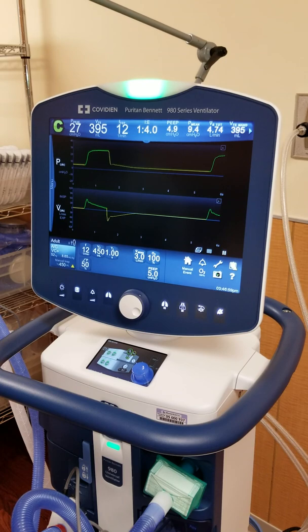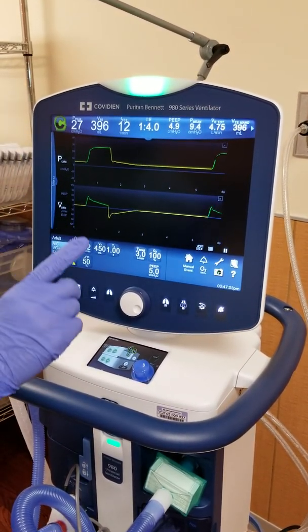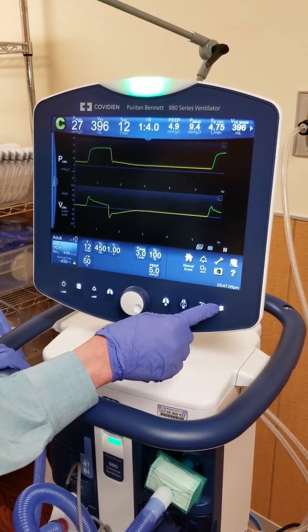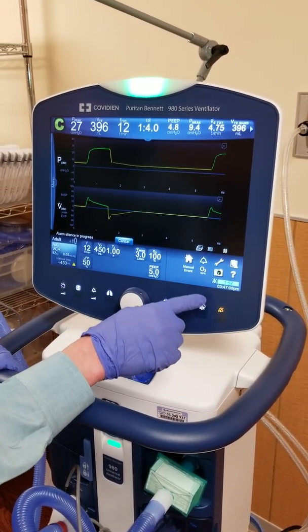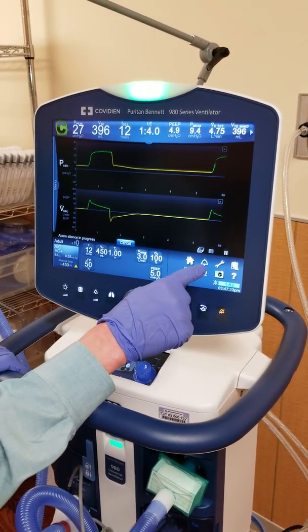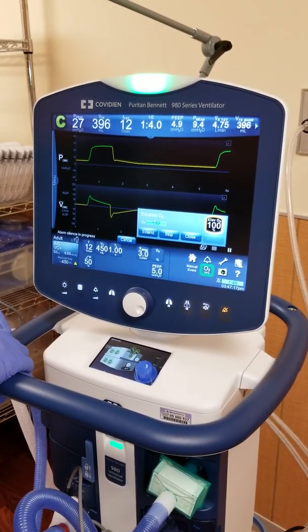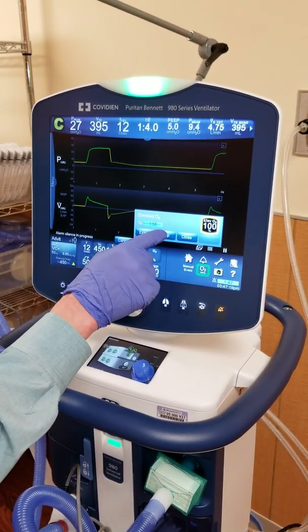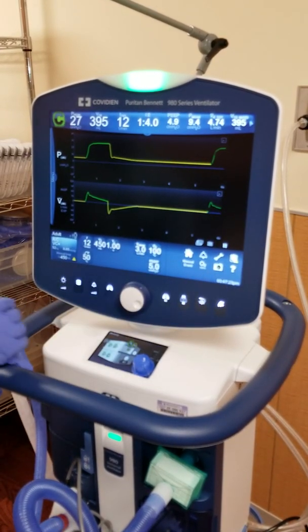Another important thing to know, this button right here is the alarm silence. That's an important one. And you see this O2 100%? You hit that and that's 100% O2 for 2 minutes. What we're going to do is we're going to stop that and we're going to cancel that.